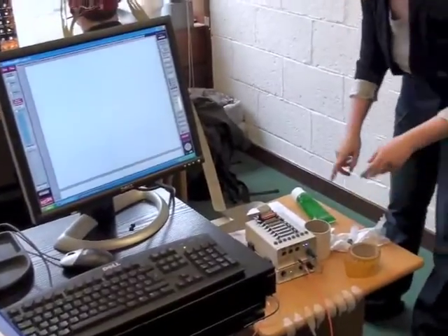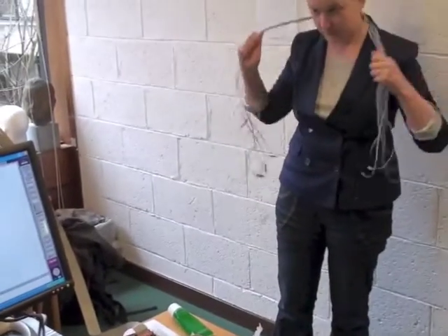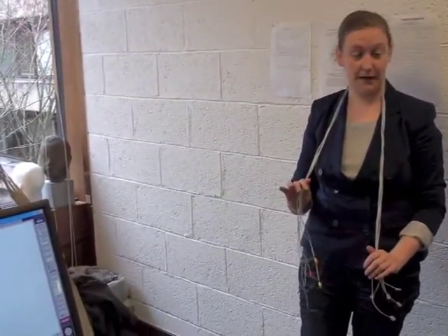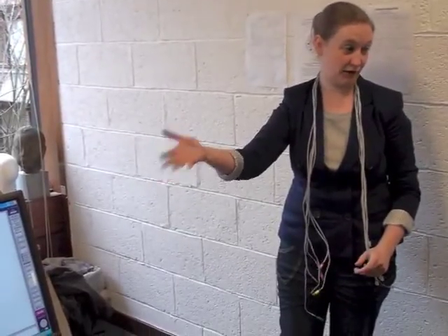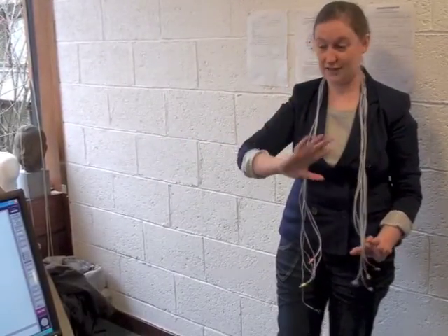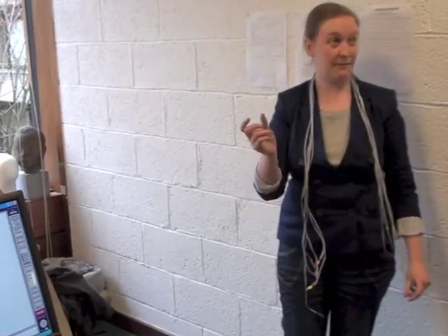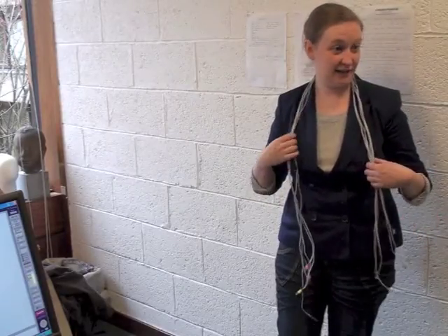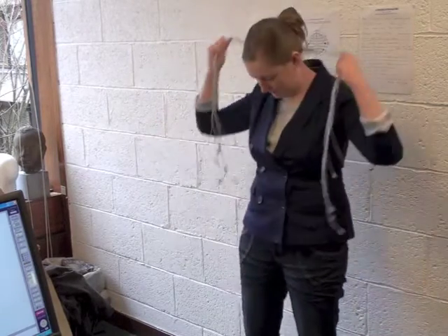Yeah. The other thing I found, depending on the room you're in, is electrical interference of 50 Hz. I panicked because it even comes up on this, you can see that it's not really happening right. But all that you do is keep going calmly and record it, and at a later stage you apply what's called a notch filter, which notches out all 50 Hz activity, and you get completely clean data again. Right, right. So you have to make sure, obviously, that we're at 50 Hz, it's usually set to 60 for America or wherever 60 Hz is.